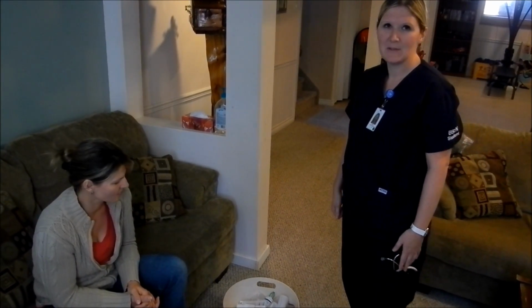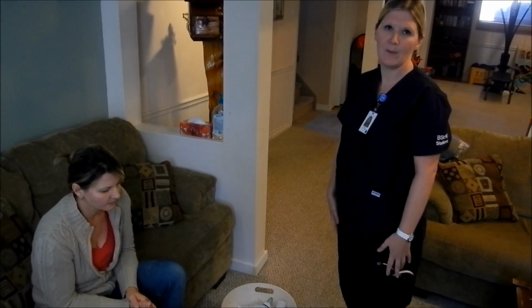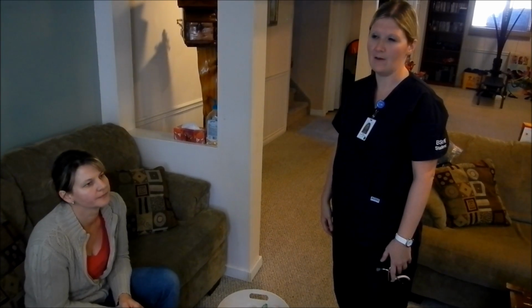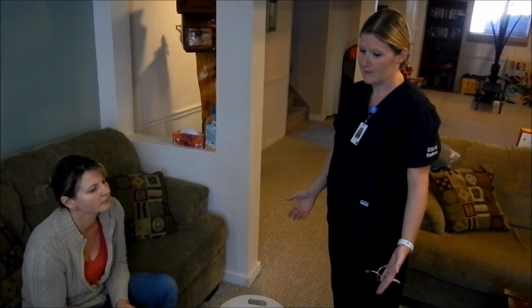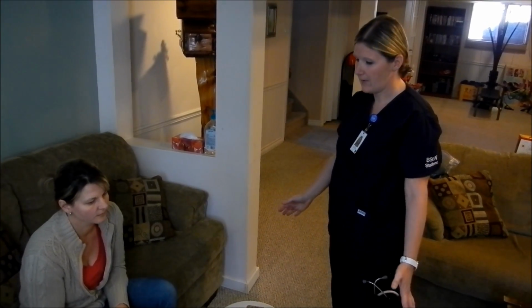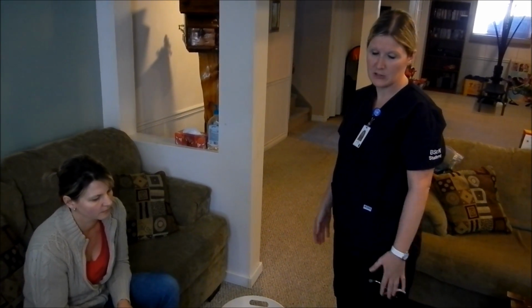Hi, we're nursing students and we're just going to show an example of how we would change a dressing in a home care environment. So the first thing you would do is come in and try to find an area that's appropriate to do the dressing change.